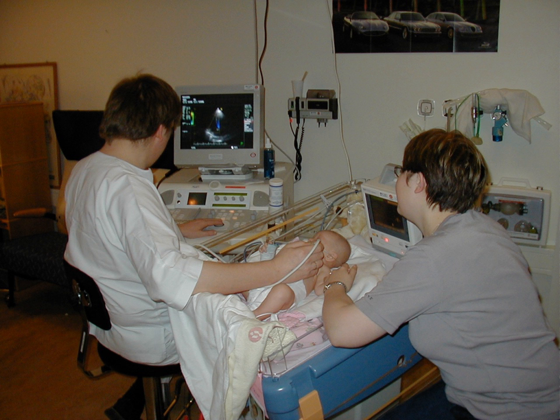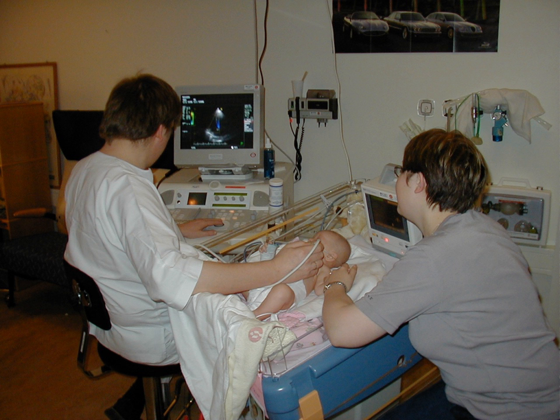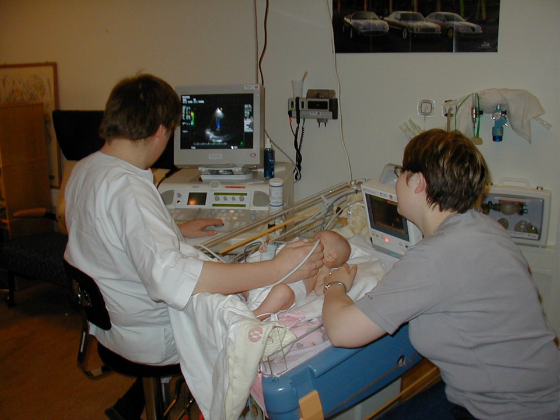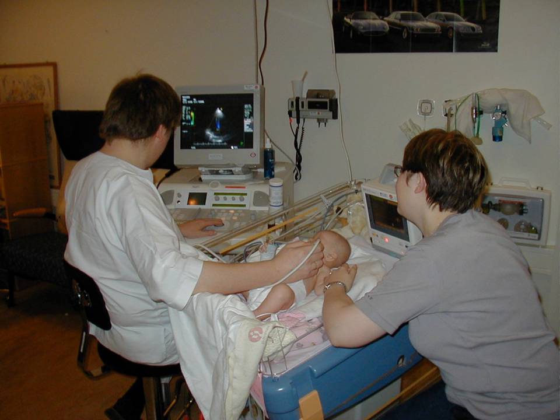Ultrasound is routinely used in urology to determine, for example, the amount of fluid retained in a patient's bladder. In a pelvic sonogram, organs of the pelvic region are imaged, including the uterus and ovaries or urinary bladder. Males may be given a pelvic sonogram to check on the health of their bladder, prostate, or testicles — for example to distinguish epididymitis from testicular torsion. In young males, it is used to distinguish benign testicular masses from testicular cancer. Sonographic imaging of the pelvic floor can produce important diagnostic information and represents a useful tool for patients with symptoms related to pelvic prolapse, double incontinence, and obstructed defecation.